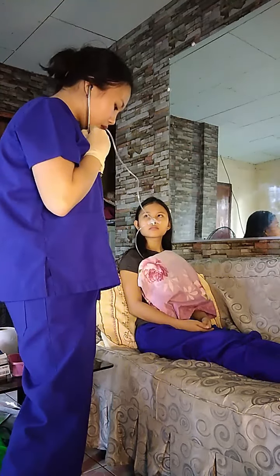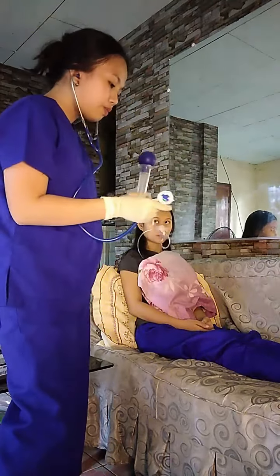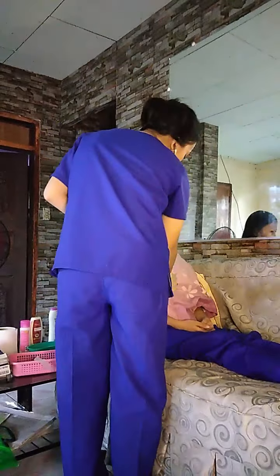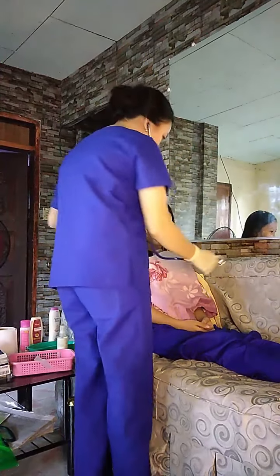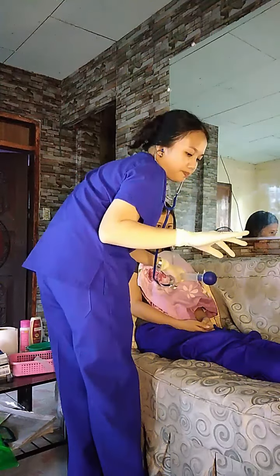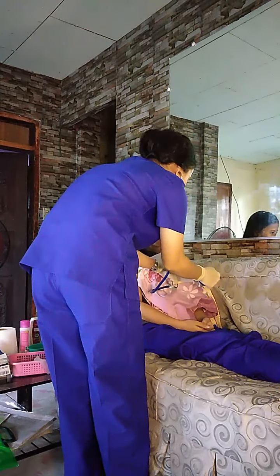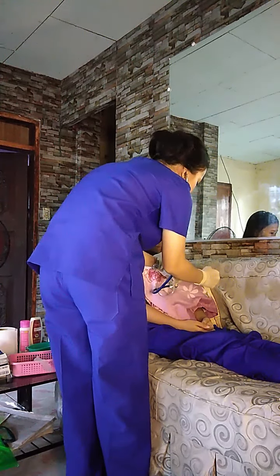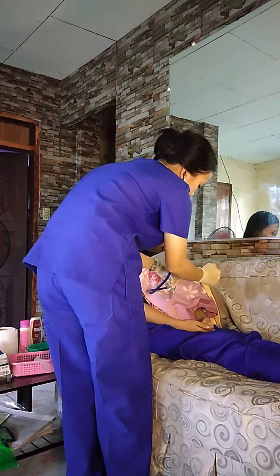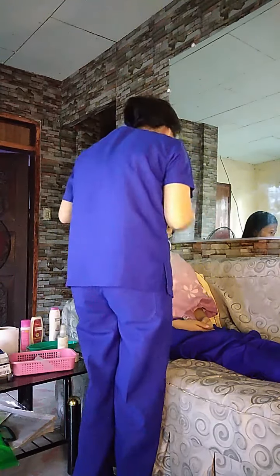Tapos, susuotin ko siya. And then, bago ako mag-inject ng air, ipi-place ko muna yung diaphragm ng stethoscope sa may xiphoid process area ng patient as I inject air. So what I'm auscultating for is the whooshing sound, which is produced by the air that we are injecting to the stomach. So ayan, narinig ko na ang whooshing sound.